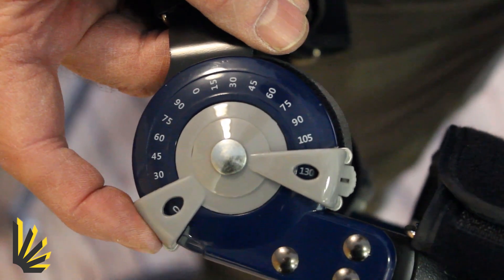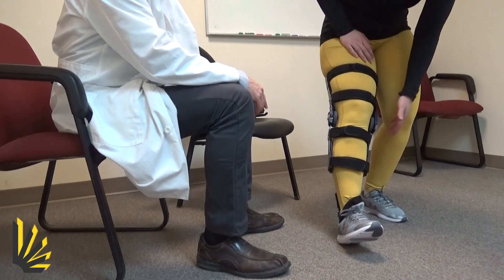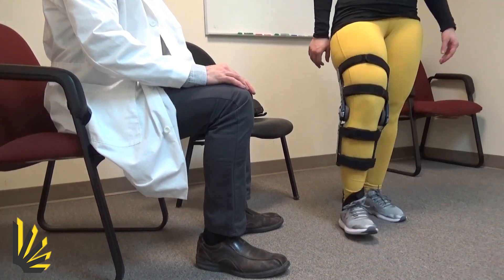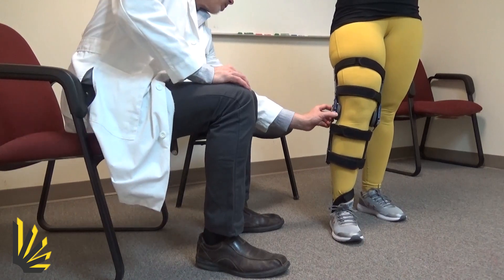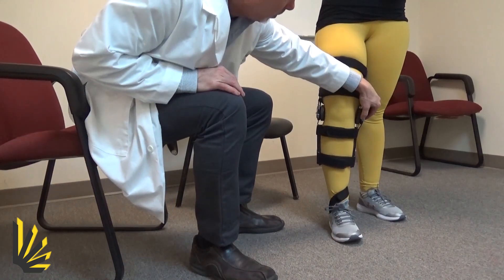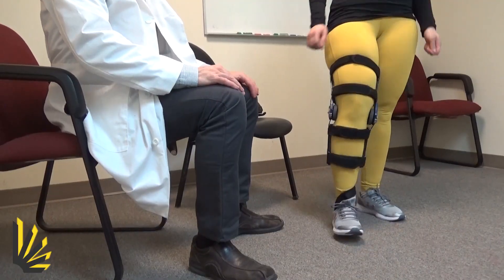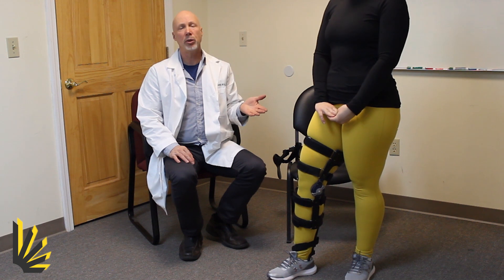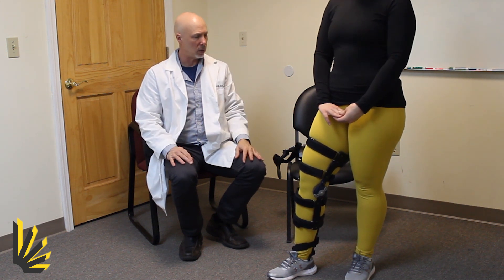We'll move these stops to 30 degrees — go ahead and do that on the other side. Now go ahead and try to extend it. You feel that extension stop there? Yes. So what happens is she's still able to use her knee, but the brace protects the knee from too much hyperextension movement force.